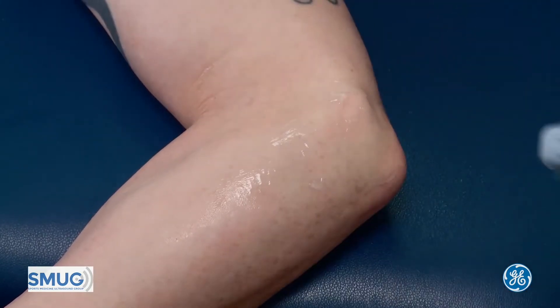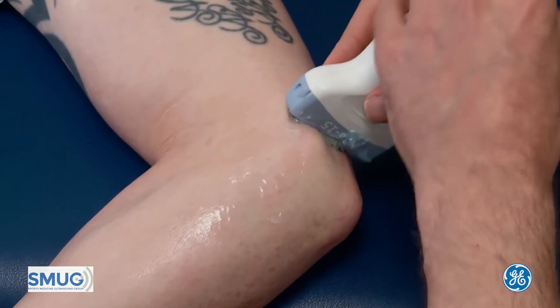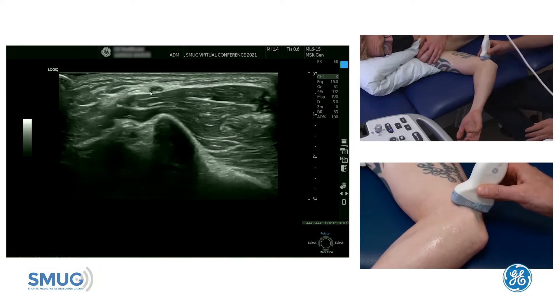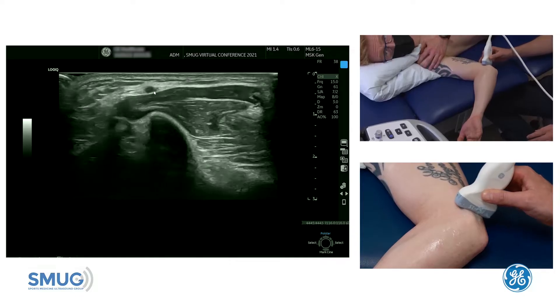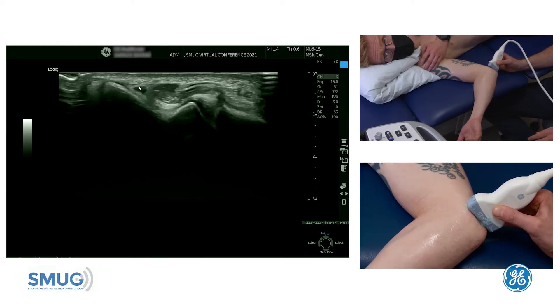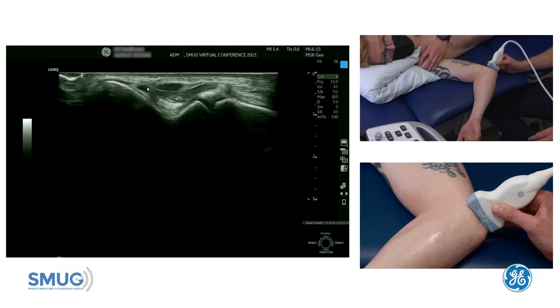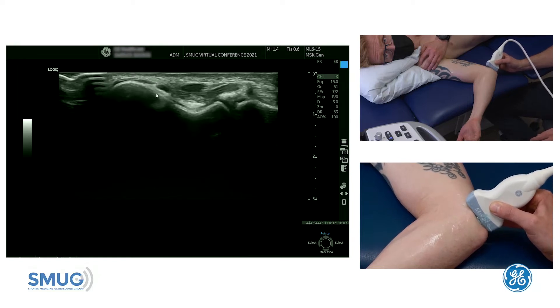Then what we're going to look at is the ulnar nerve. I like to pick up the ulnar nerve just above the medial epicondyle, so we're in transverse now. We must make sure that we toggle the probe and we see the ulnar nerve there just next to the triceps. If we follow the ulnar nerve down into the tunnel, you can see the ulnar nerve over the top, Osborne's ligament, with the medial epicondyle on the medial side and the olecranon on the lateral side.